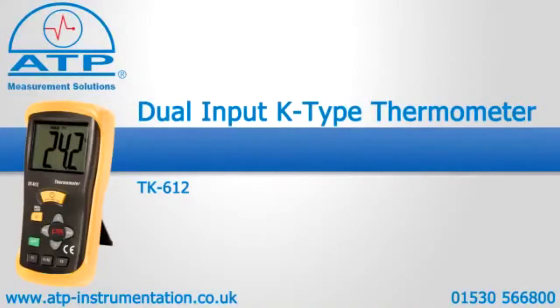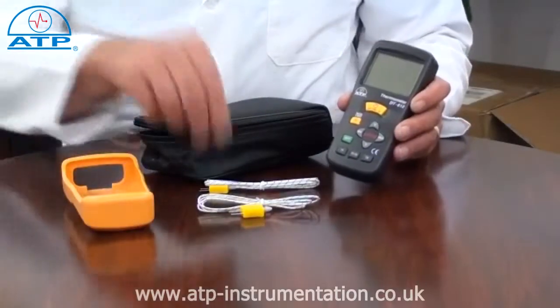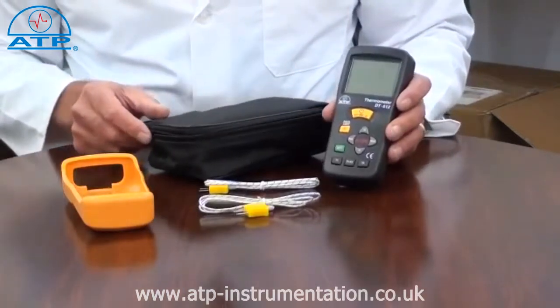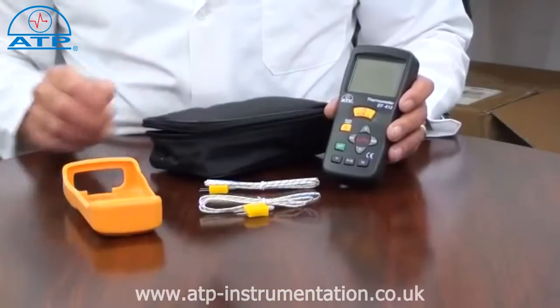An introduction to the TK612 dual input K-type thermometer. It is supplied with two 1m long plug-in wire thermocouple probes, a rubber protective holster, a soft carry case and battery.